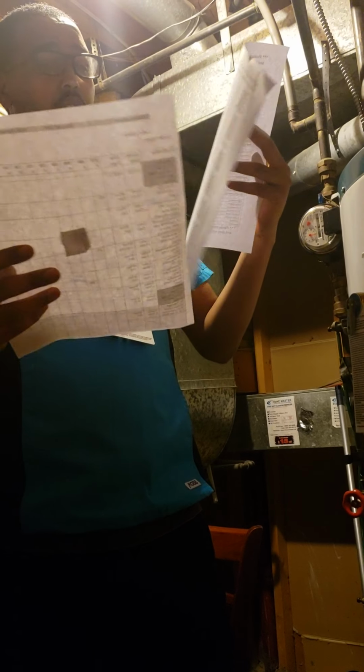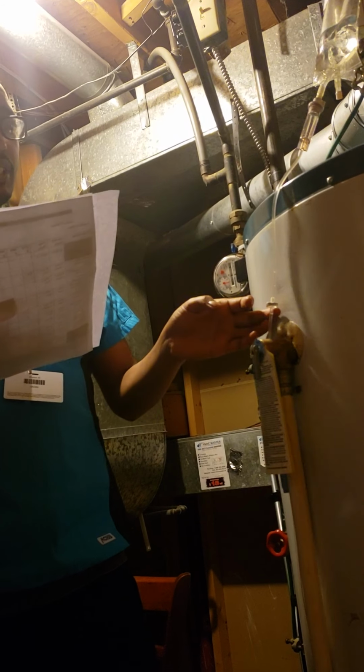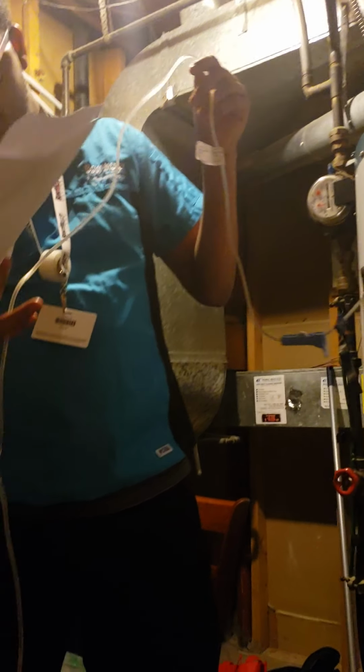So I have to check for the compatibility. Dexamethasone is compatible with 0.9 sodium chloride, and this is 0.9 sodium chloride, so it is compatible. I have to check for any kinks or air in the tube. There are no kinks or air in the tube. Okay, it's good.